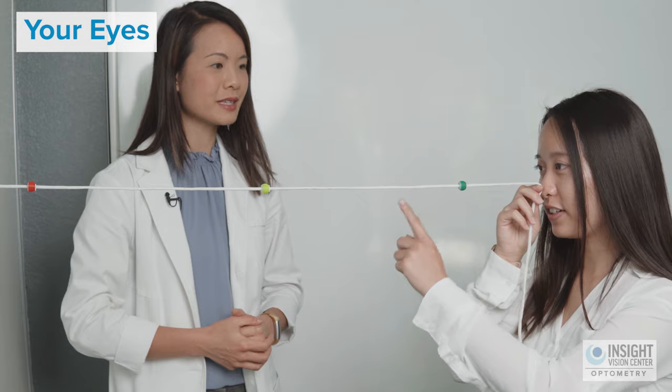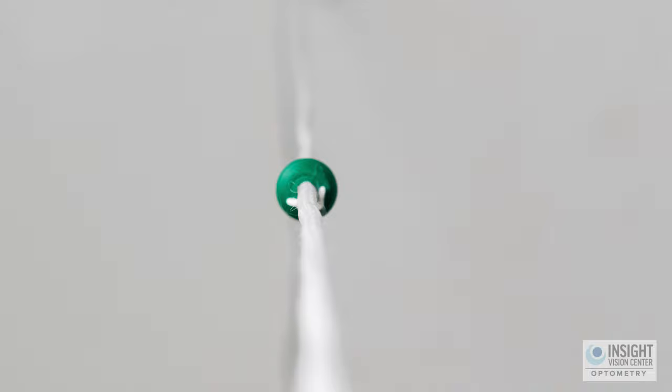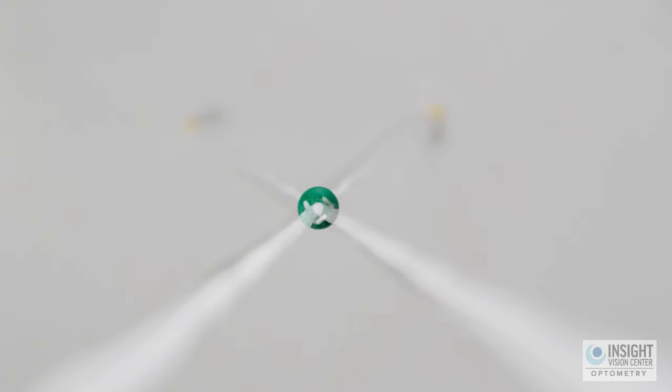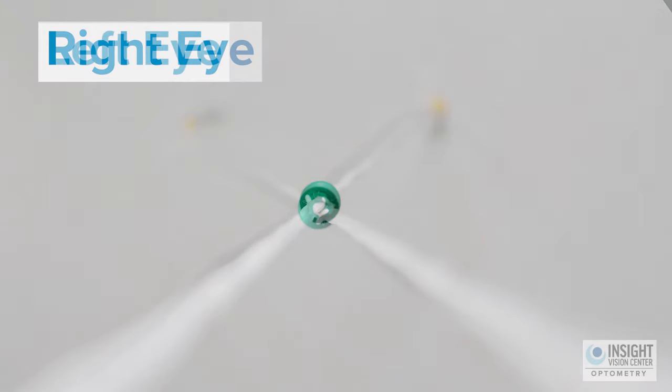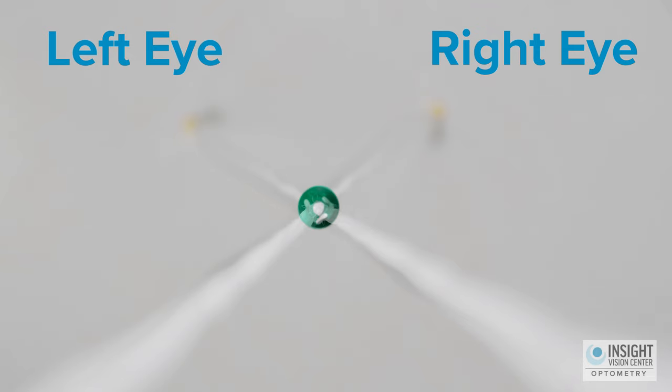In this exercise, we instruct patients to look at a single target — either a bead or a point on the string. When looking at that target, the right eye and left eye should be pointing at the exact same point in space. If that happens, the Brock string splits into two strings: one image from your right eye and one from your left. These strings should be meeting exactly at the target you're looking at — for example, at the green bead.